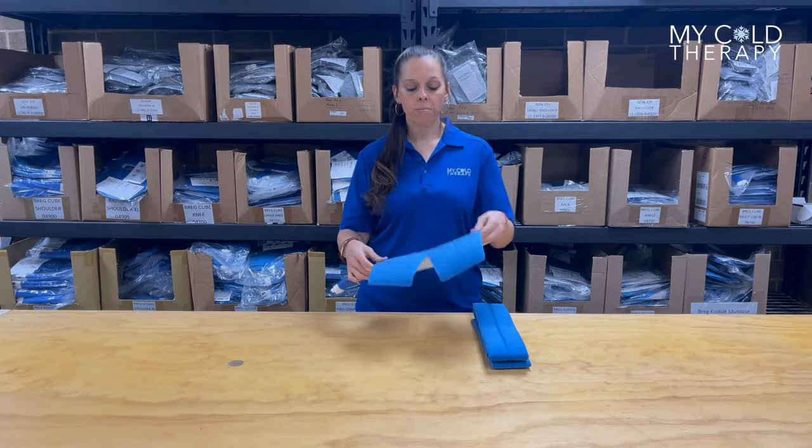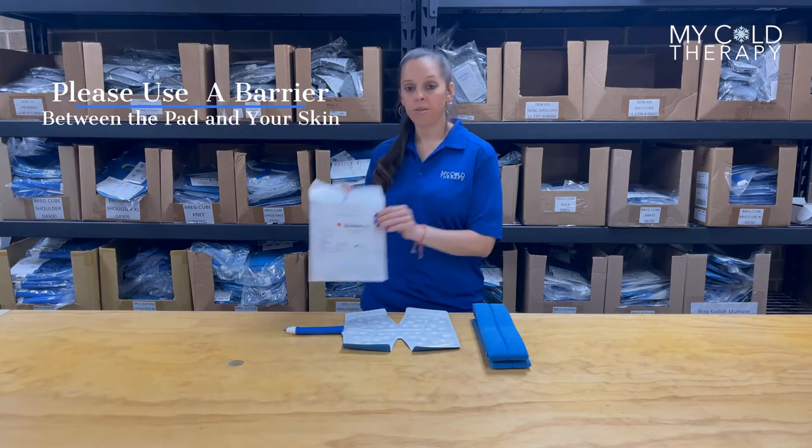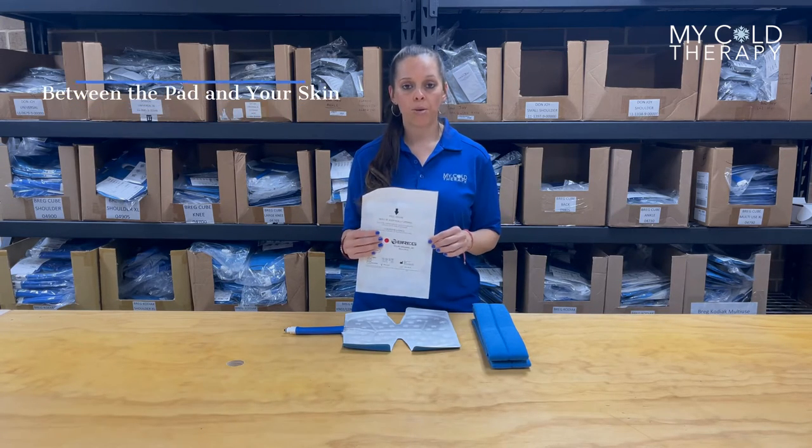As always, make sure you have a barrier in place between your skin and the pad. We do sell sterile dressings that you can use, or you can use any type of barrier you want.